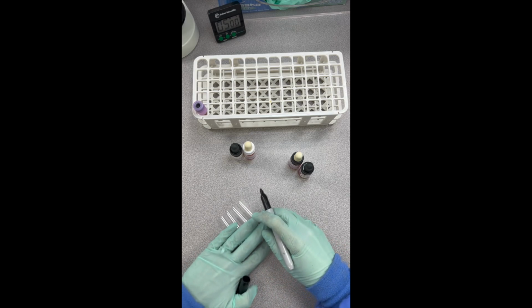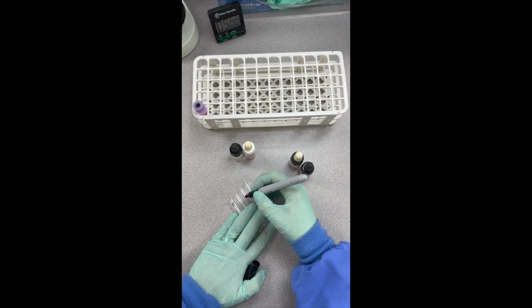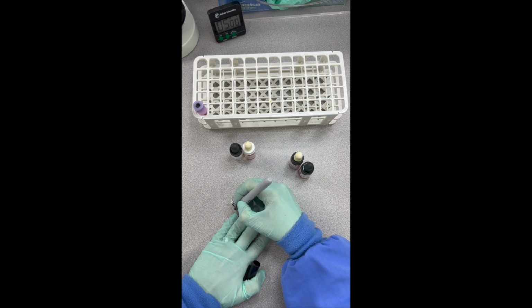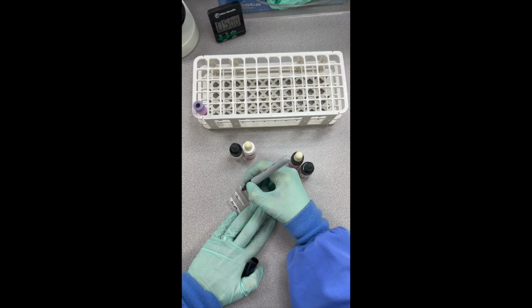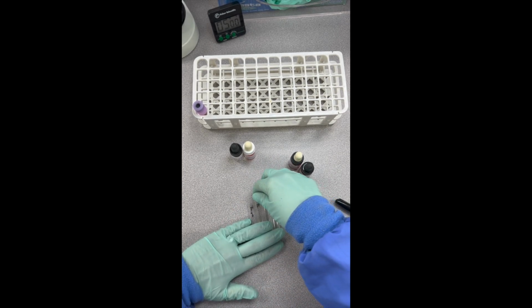So let's get our tubes ready. What we're going to do is have a patient, and I'm going to have 2 patient tubes here because in this one I'm going to make out my 3 to 5% cell suspension, or sometimes you're going to see some of your procedure manuals may say 2 to 4. And then I'm going to have my test tube right here that I'll perform the test in. I'm going to do a positive control, and I'm also going to do a negative control so we can see those results today. So there's my tubes.